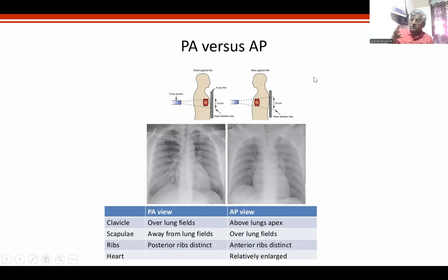If you shoot from long range versus if you shoot from close range, you can remember that effect of smoke that happens at the entry wound. That is because an AP you will take to the ICU or in the area where you want to take the X-ray, and take the X-ray source close to the chest and shoot. You understand? So that means the X-rays from an AP are divergent and an X-ray from PA are parallel.